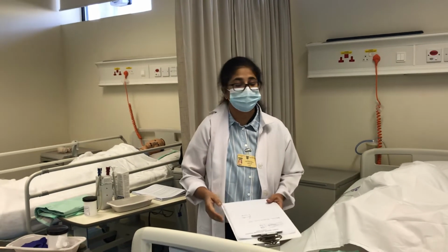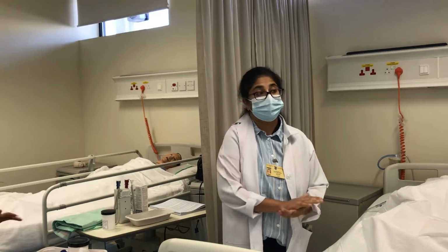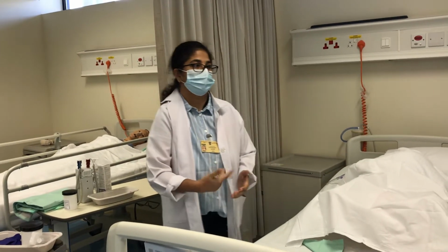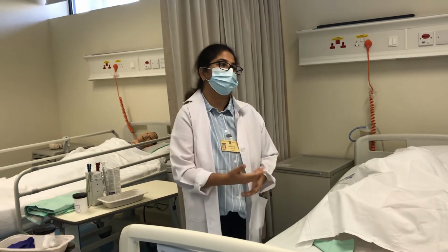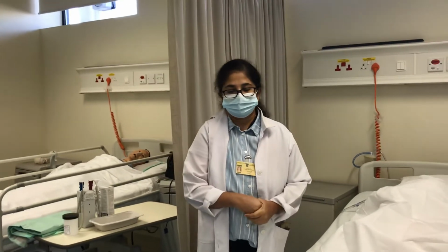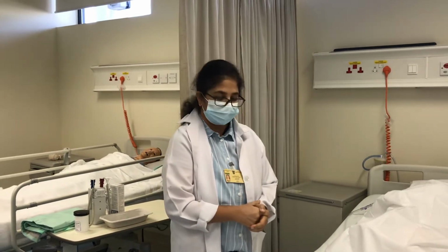Another important one is to empty the bladder before the surgery, and also to provide a continuous or intermittent bladder drainage. So those are some of the purposes, especially in the post-operative period, after lower GI tract and other procedures, you can see post-operatively the patients will be on a urinary catheter. So these are some of the few purposes of urinary catheterization. What else? And also to manage incontinence, right? So now let's start with the order.